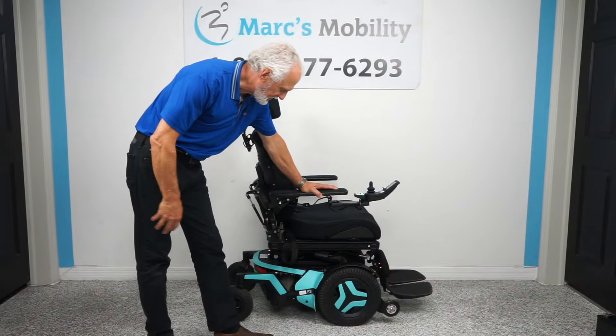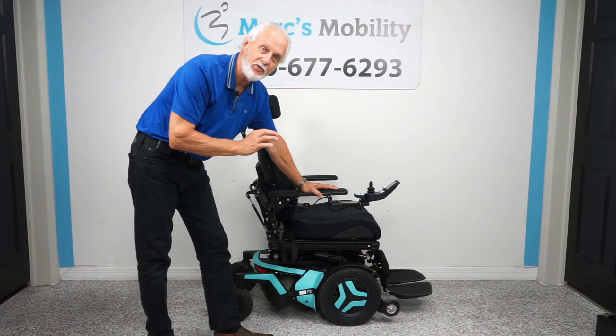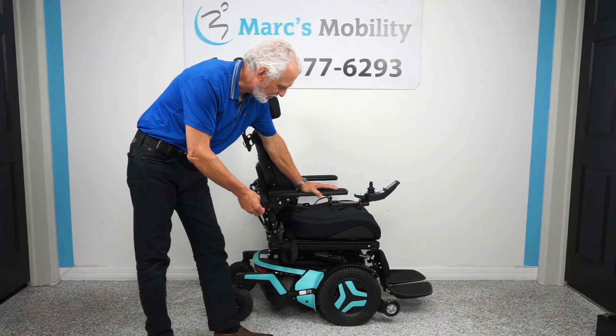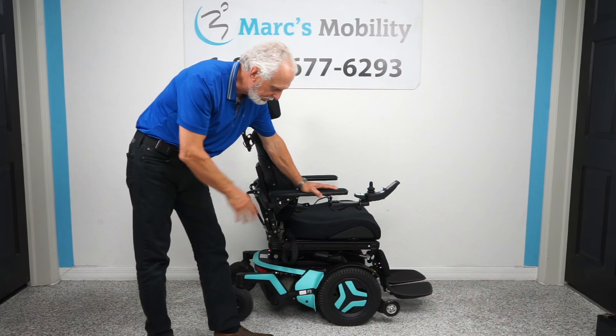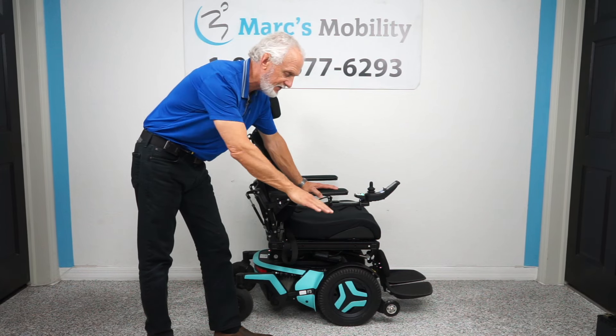Hi folks, this is a Permobil F3 power chair, fully loaded, five electrical functions. This chair has 15 miles on it — it was used less than a month, literally brand new. As you can see, the color is a teal green-blue, light blue I would say.